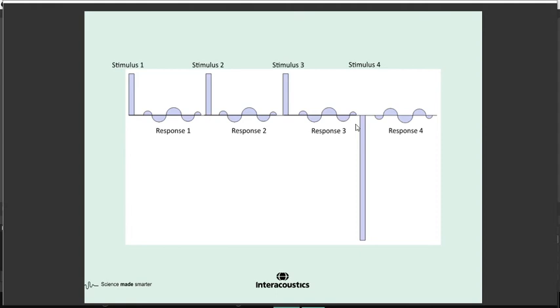And those responses that are shown on the graph there are all the same size. That's not quite reality. As you saw, it was 1.5 decibels bigger in reality, which is only about 10% more. So that's the real picture.